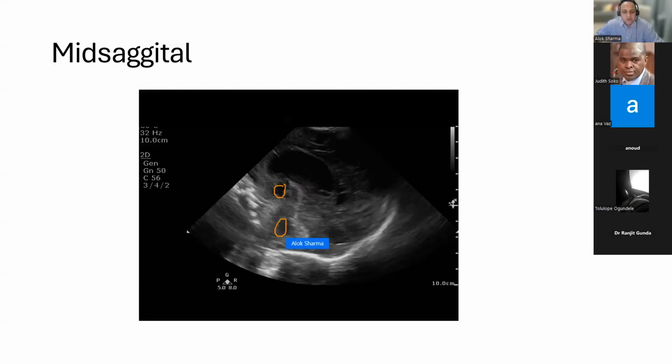The question is whether, from our perspective, you have had some clot which is causing back pressure here, which is causing the lateral ventricles to dilate. But the good thing is your vermis is clearly visible. The fourth ventricle is not collapsed. So there's definitely CSF moving between the third ventricle and the fourth ventricle. And at this particular point that would bode well for this baby. You'd hope that CSF can still drain into these spaces and then into the foramen of Magendie and Luschka and then get absorbed by the arachnoid villi. So it's a great image.